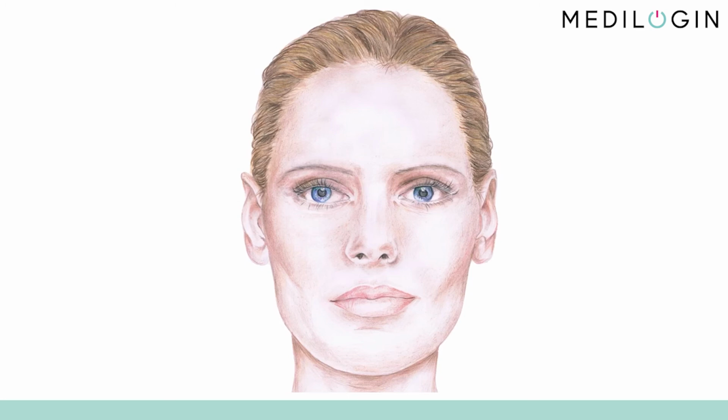In this lesson, the last of the injection techniques, we'll discuss the treatment and injection of the buccal region, also known as the cheek. The goal is to achieve a harmonious and balanced appearance of the midfacial region. The windmill technique is a deep horizontal augmentation technique which makes use of just one injection point to harmonize the middle of the face.